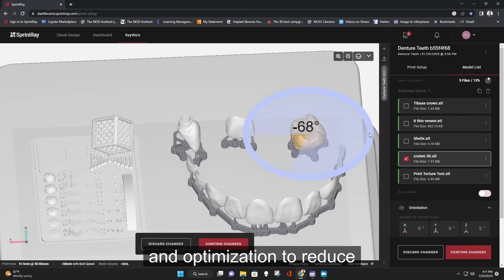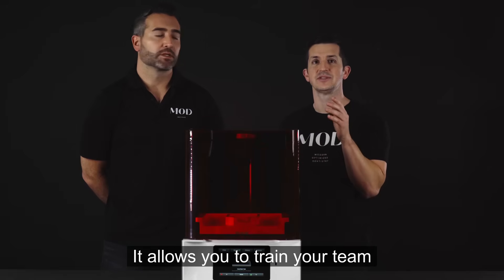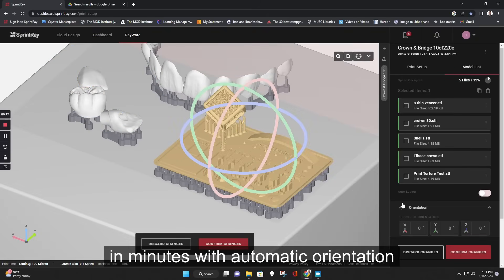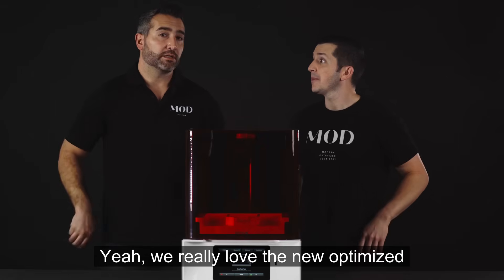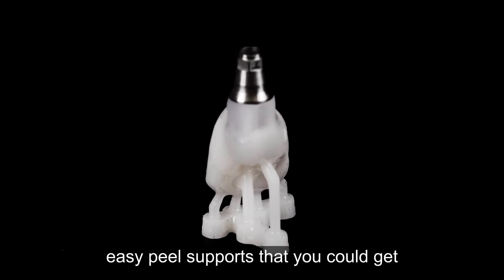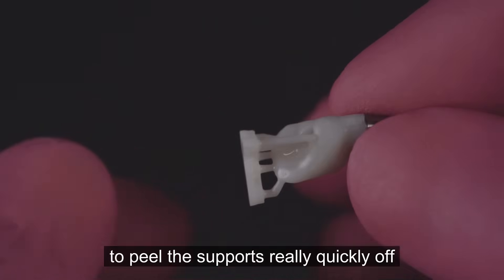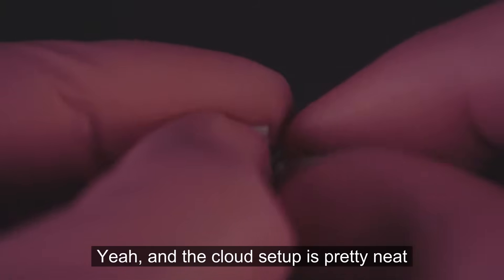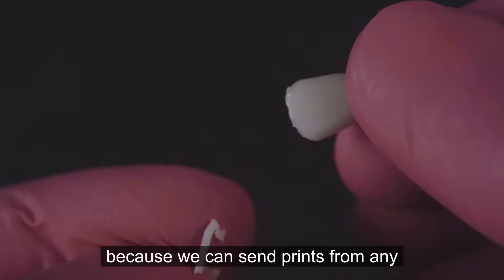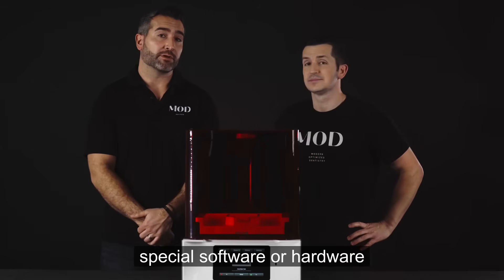Rayware Cloud uses machine learning and optimization to reduce the number of clicks to print. It allows you to train your team in minutes with automatic orientation, supporting, and build platform layout. We really love the new optimized easy peel supports from that software that enable you to peel supports quickly off the print without damaging the actual product. The cloud setup is neat because we can send prints from any computer in the office without needing special software or hardware.